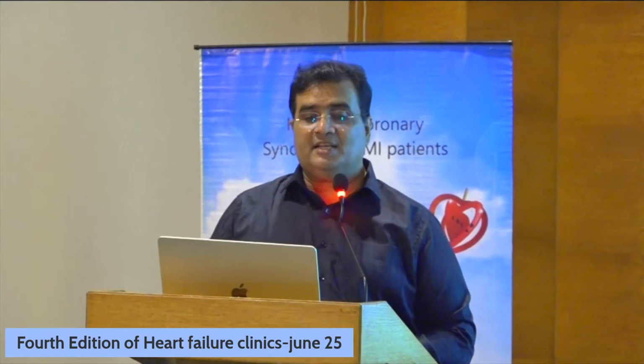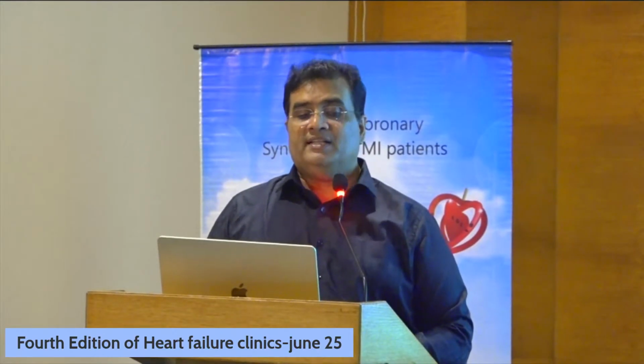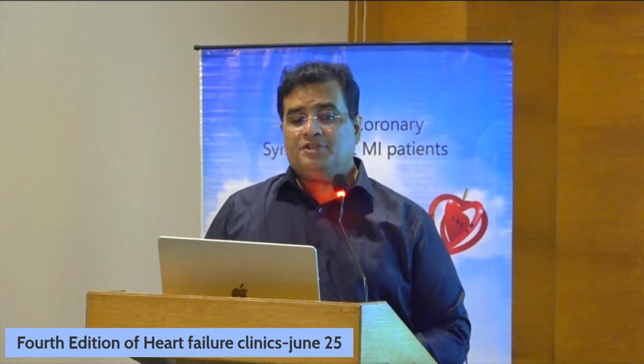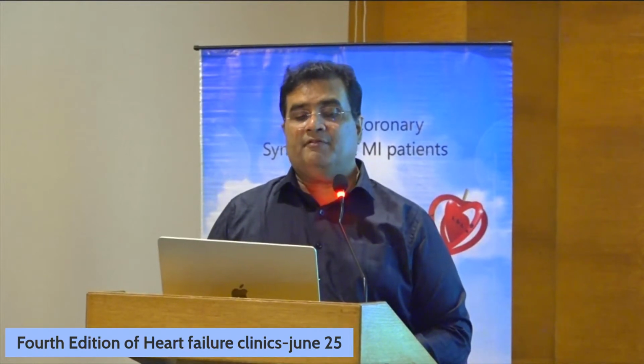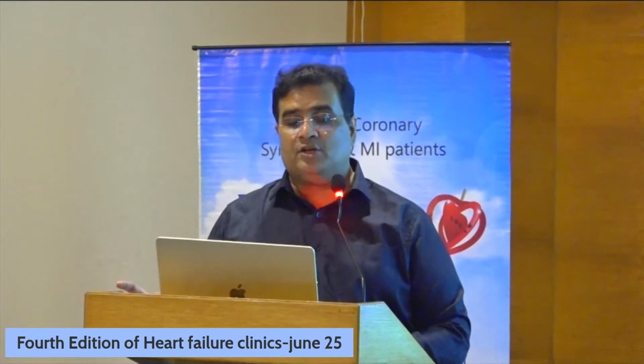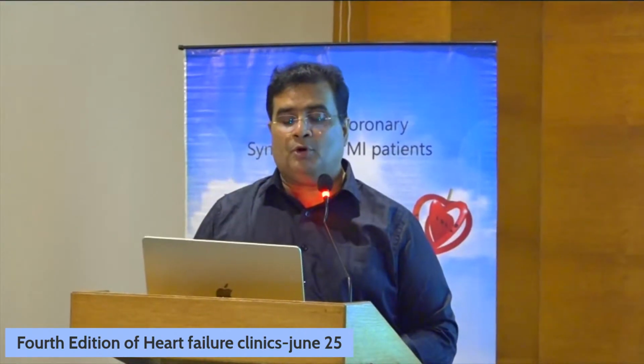Now, what is the role of CT coronary angiography in new onset heart failure? This is a study which was published a couple of weeks ago, which showed that if a patient with new onset heart failure has CT angiography as the first test, and it shows no coronary artery disease, you can safely continue them on medication.